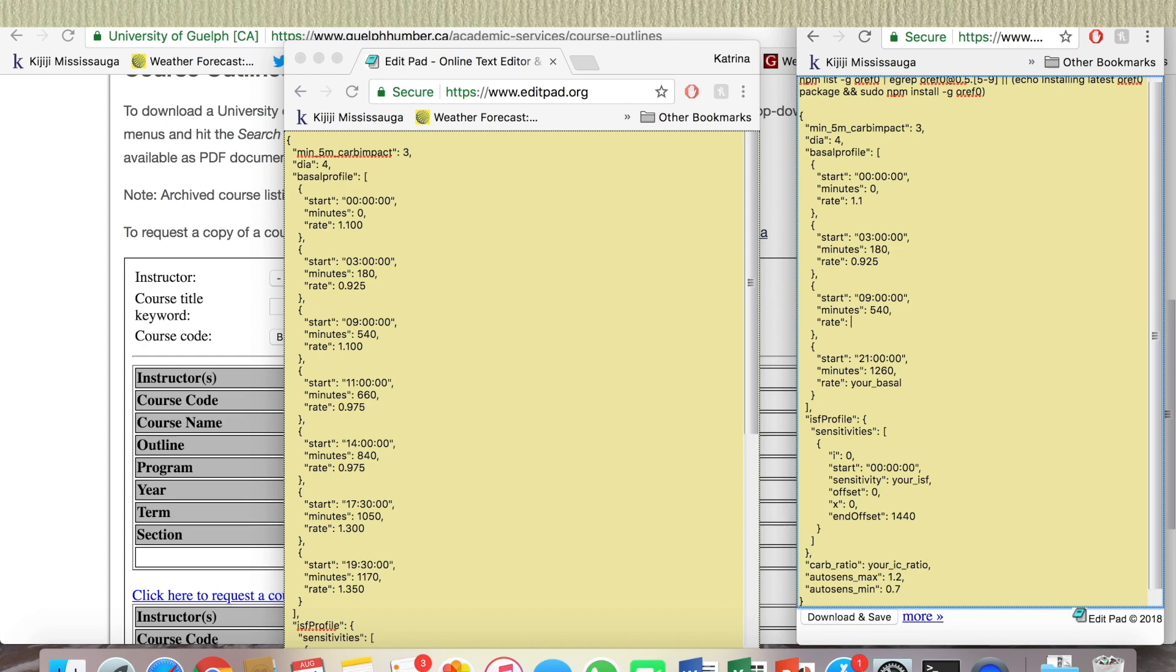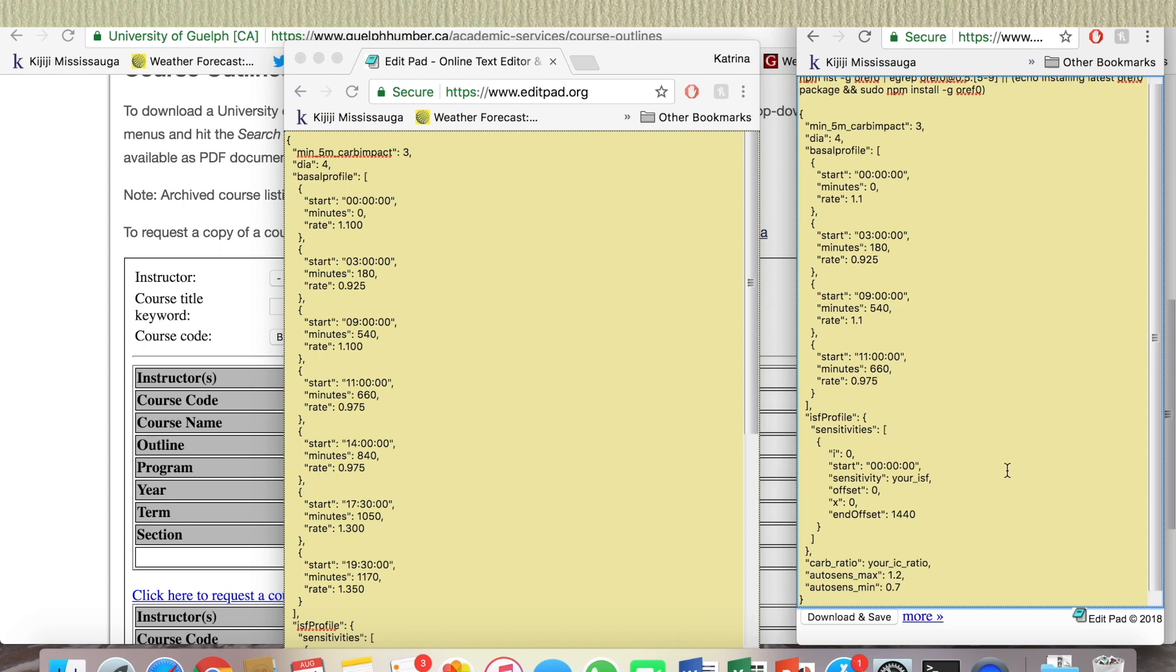Basal rate is one point one. We have eleven o'clock, we have six sixty, basal rate is zero point nine seven five. So this is where I had to add more.